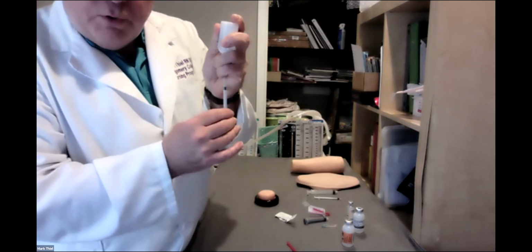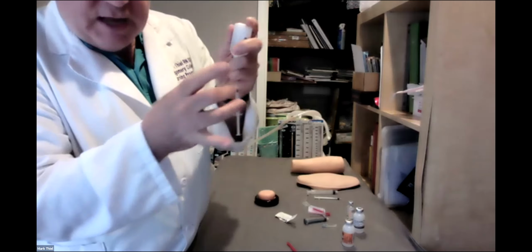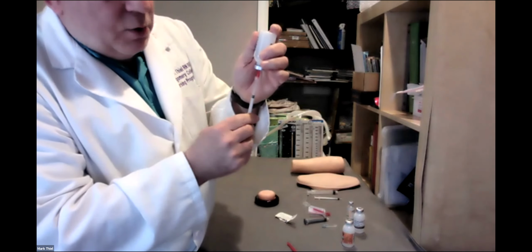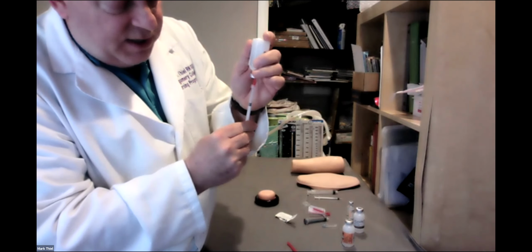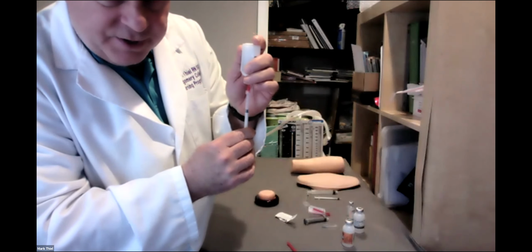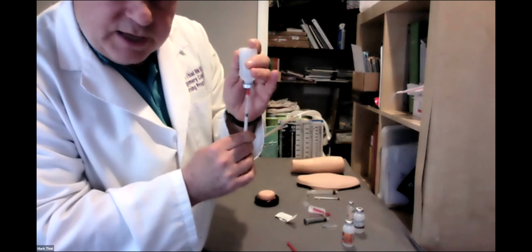Holding both together, I snap, snap directly at the bubble, and it may go up all the way to the top, and then I just push the bubble away, injecting medication back into the vial. That's why we hold both together.